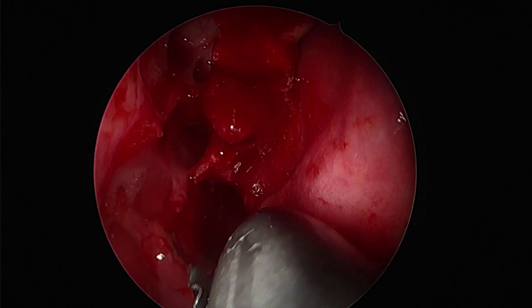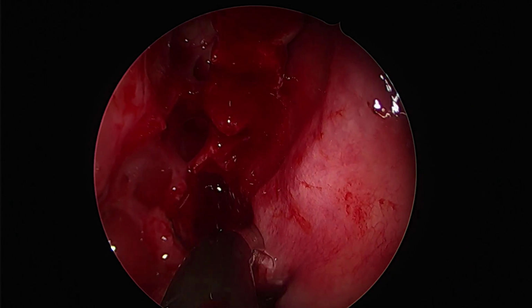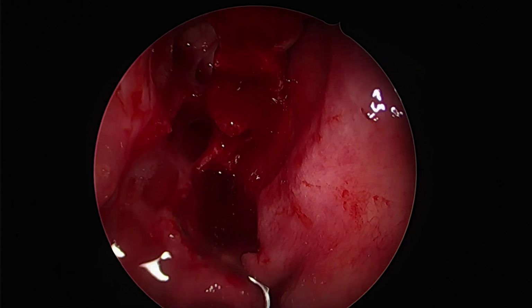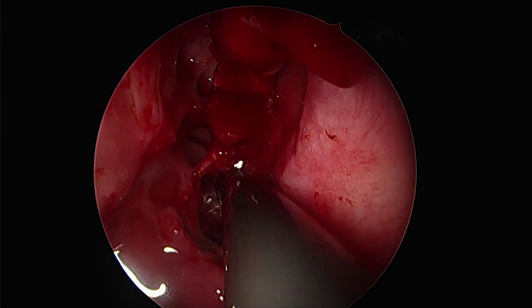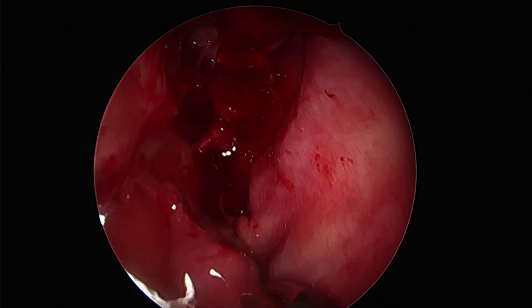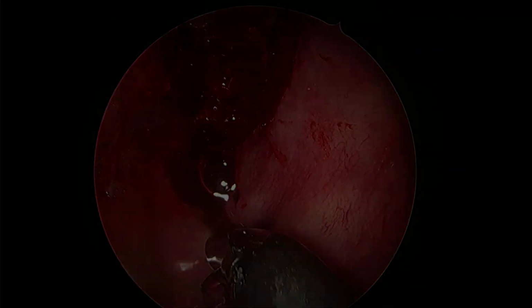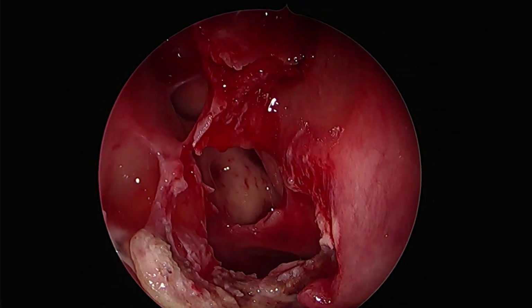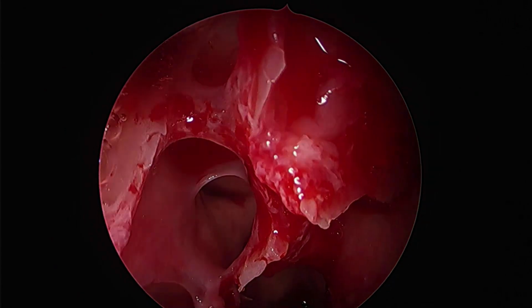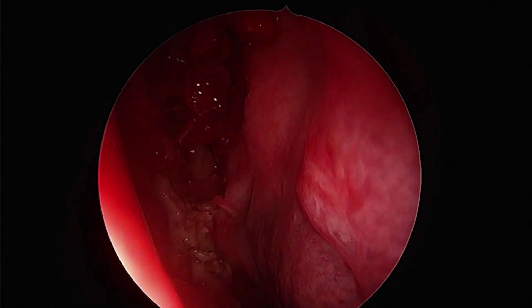At the same time, we can use this on the ablative mode to reduce this hypertrophied soft tissue onto the posterior inferior wall of the erstwhile antrostomy, to create some more nasal patency. While using the coagulator, one must also be mindful of which mode we are using, whether it is ablative or whether it is coagulation.